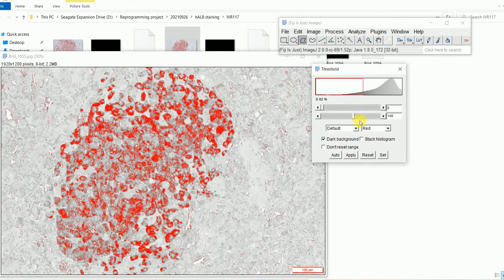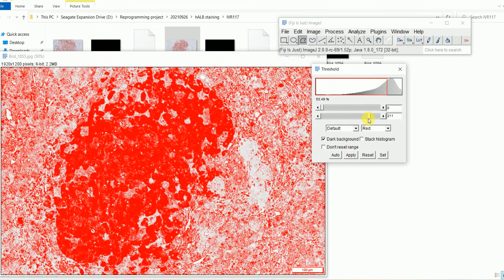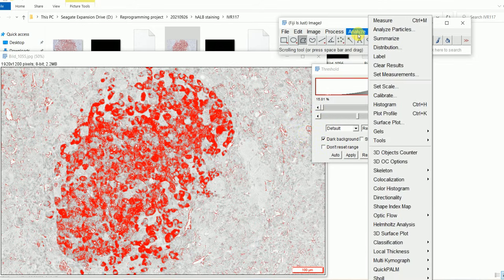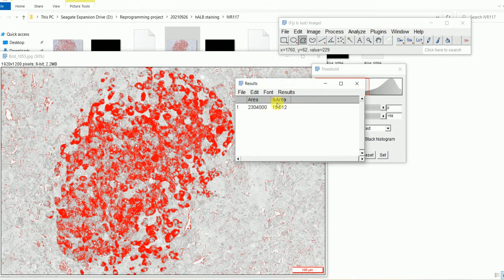So while you are moving this left and right, what you need to pay attention to is that, for example, if you do it like this, this whole area is red. This is what we don't want, because our original image only has this part red. So we will adjust in such a way that only this area becomes red. Here also I see something red, but let's say more or less this is what our original image looked like, right? After doing this, I'm going to click on Analyze, and then I will press Measure. So 15% of my image area is positive, and this is my area. This is how you can quantify.